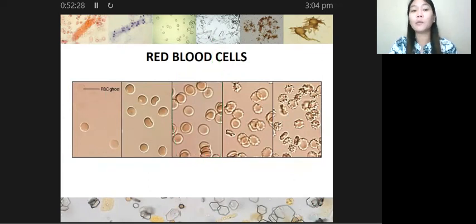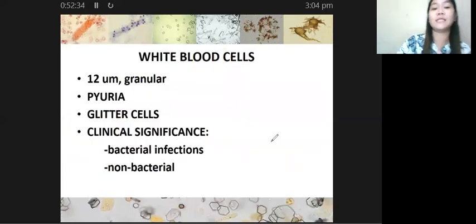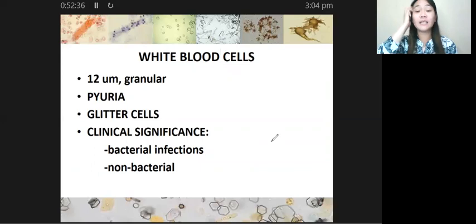Siguro tapusin ko lang yung WBC and then end ko na. So another, we have your white blood cells. Alright, sige.